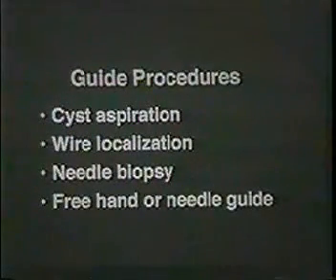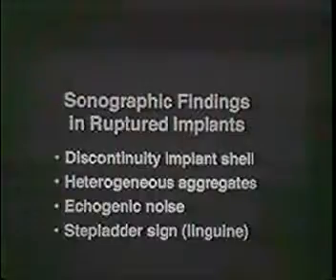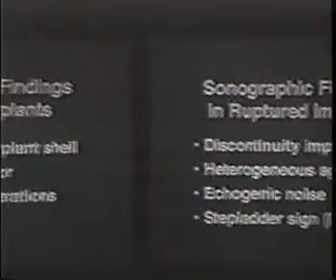And often when we do a biopsy, we want to show that the needle is within the lesion, and that's one of the benefits of sonographic guidance. It can be done with real time, so that there wouldn't be any question but that this particular specimen came from within the lesion. And we do that in 2 directions.